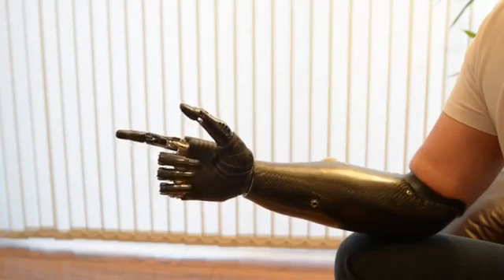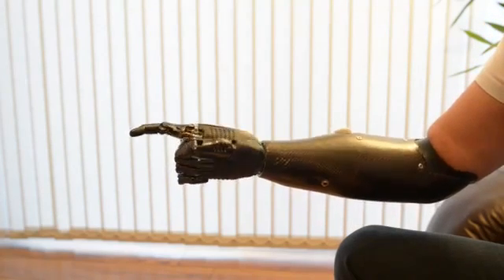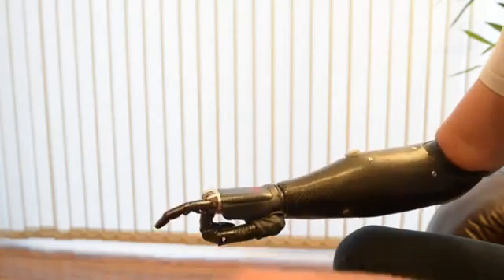I now move to a point grip — pretty self-explanatory. This one will allow me to type on the keyboard.